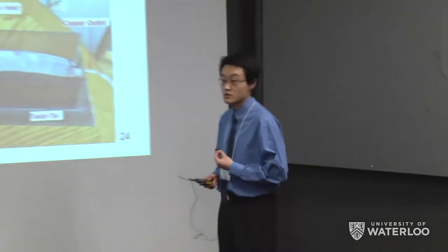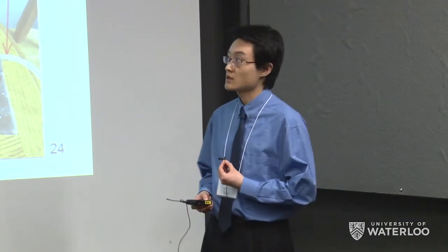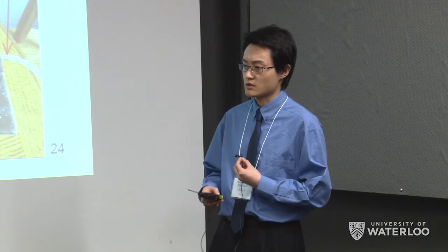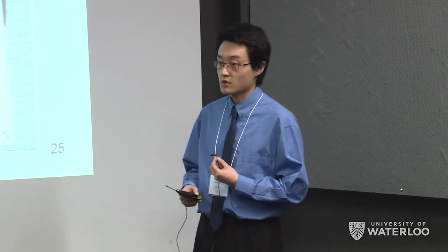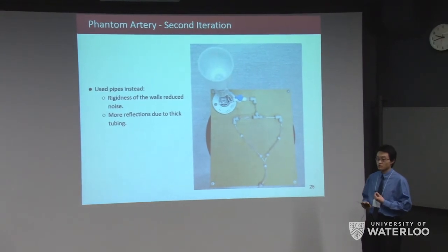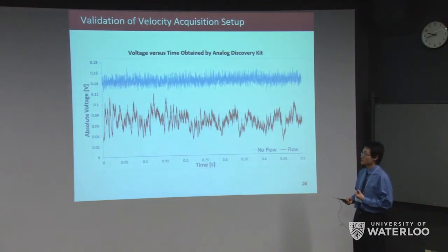To test our velocity acquisition setup, we built a phantom artery since we couldn't get results using our own arm. The first design used sausage casing to mimic skin and reduce reflections; however, when filled it expanded and moved the transducers, causing significant noise. A second phantom artery used tubing instead — its rigidity reduced noise, though the thicker walls produced more reflections. Comparing signals, the blue (no flow) signal was relatively constant, while the red (flow) signal showed clear fluctuations.